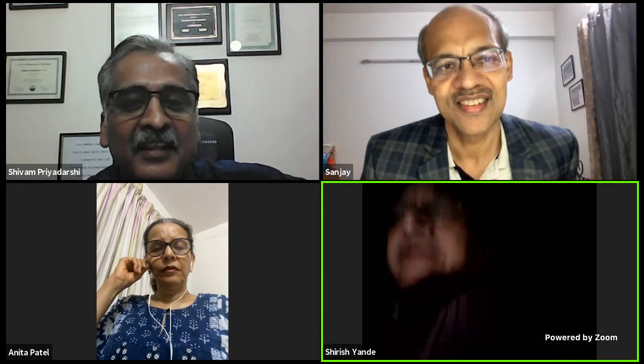And that's just one point, Shivam. As Sanjay said, it's a three-step performance of urodynamic studies. The person who takes the history first generates urodynamic questions, and that has to be a clinician. It cannot be a technician. We must understand what we are looking for. Are we looking for detrusor overactivity? Are we looking at detrusor function? Are we looking at safety of the bladder? Are we looking at the mechanism of incontinence? Urodynamic questions must be generated and clearly defined before urodynamics can actually be performed. So you tailor every investigation to the patient's needs, and then the technician knows exactly what is to be done in this particular case. Do you agree, Sanjay, with this?